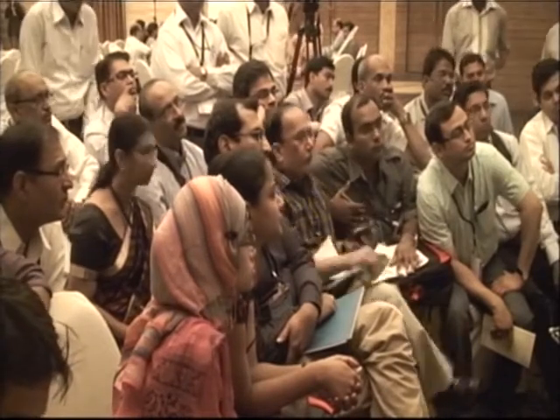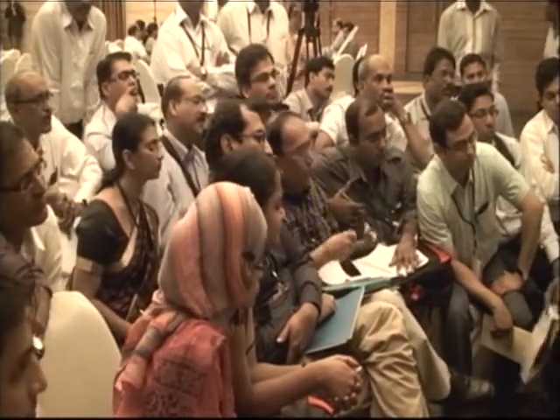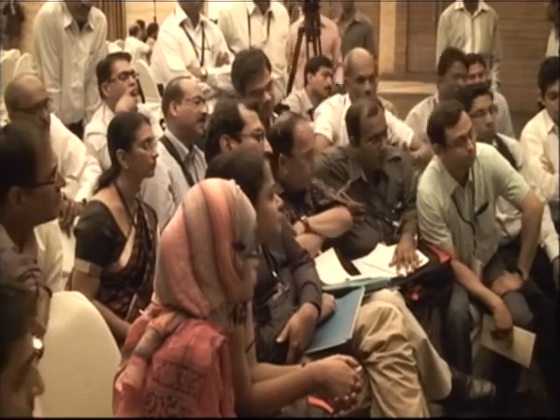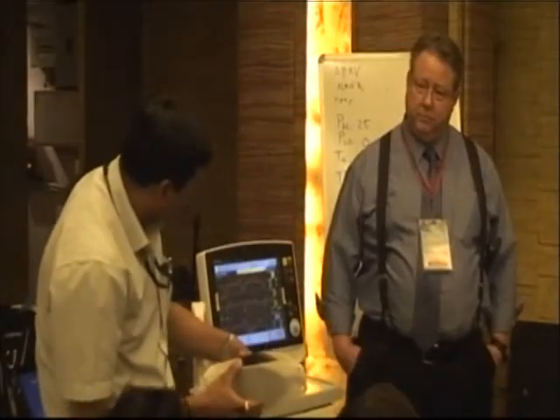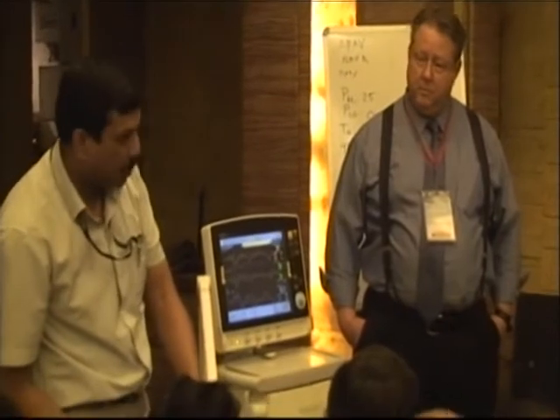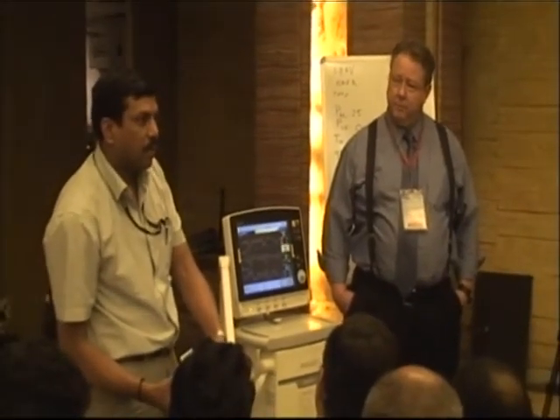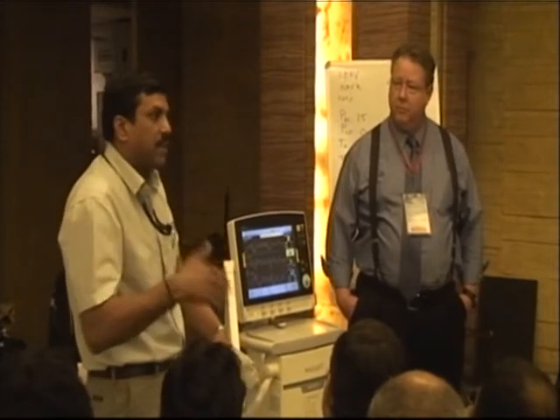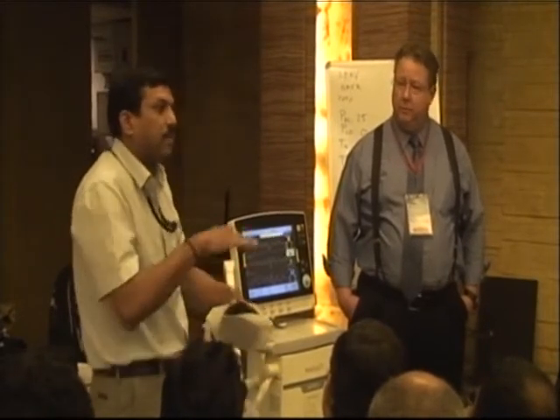Whenever the patient wants to take a breath, it will be on P high or on P low. The patient can breathe on both CPAP levels, so the mean airway pressure doesn't drop. The alveoli don't need to be re-recruited. There is continuous recruitment happening in the patient's lungs, with the mean airway pressure on the high side.